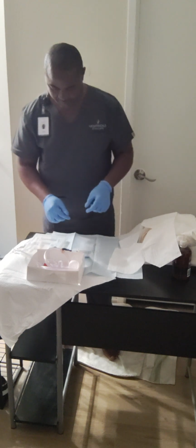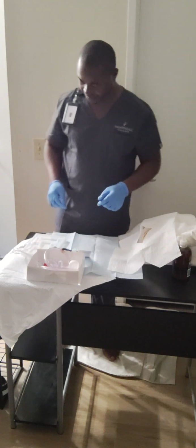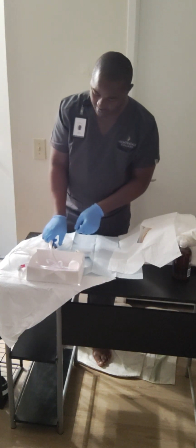Okay, and at this time I'll go ahead and set up my syringe.